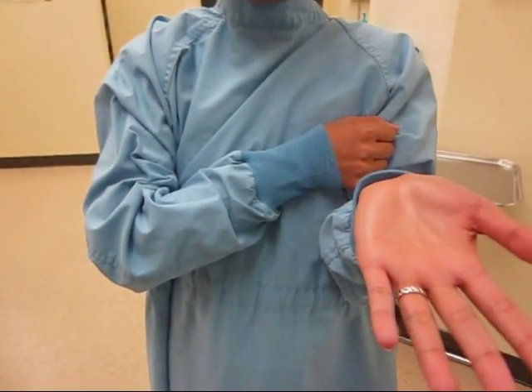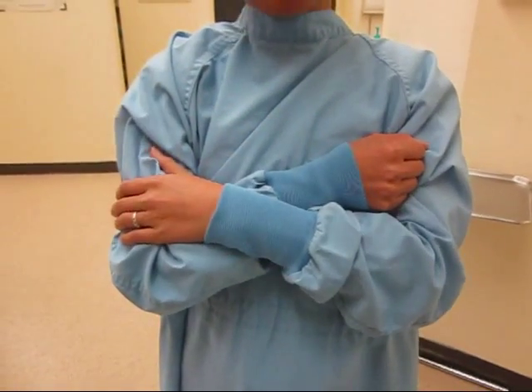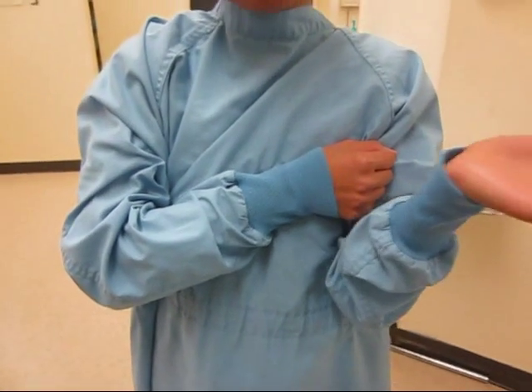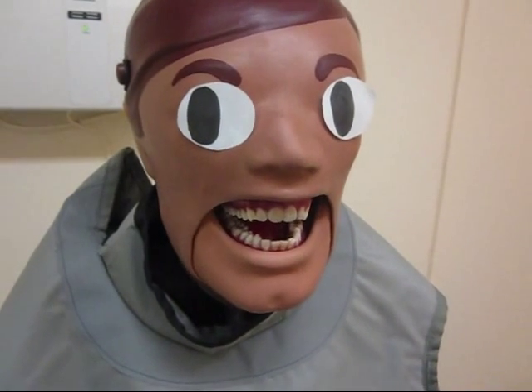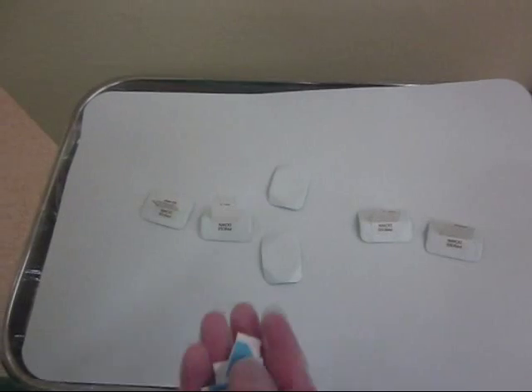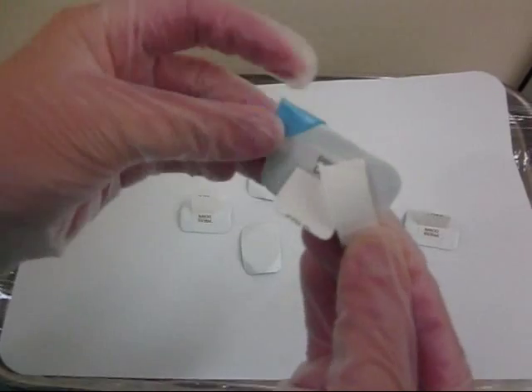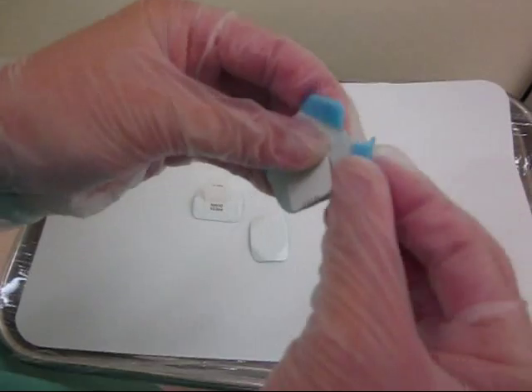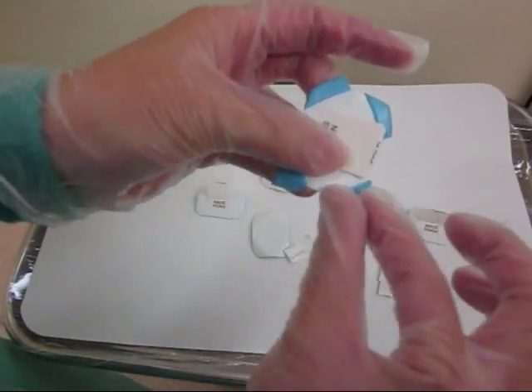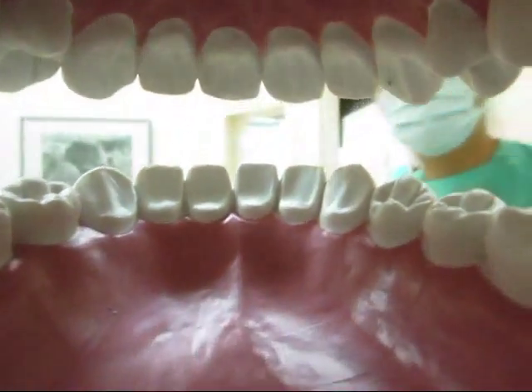Well, that's very inconvenient for Mr. Dexter. Now he has to drive back to Foothill, receive extra radiation that he doesn't need, and he has to pay for an extra set of x-rays. Is there any way you can make it more comfortable for me? Well, yes, Mr. Dexter, I can make it comfortable for you by using these blue sticky foam tabs. All I need to do is to stick it on all the corners of the film, and the corners should no longer be poking you inside the mouth. All right, Mr. Dexter, open up.